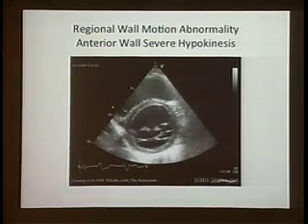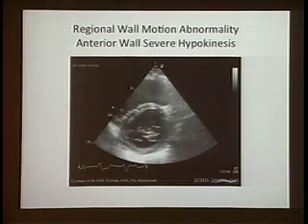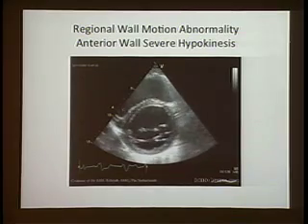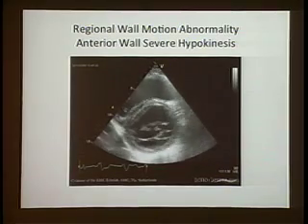And if you do an echo and you see something like this, you got a problem. And as I tell my residents, if you can pick up a problem, that's all I want from you. If you're going to pick up a phone and call me, you may not have the complete diagnosis, but if you recognize there's a problem, that's 90% of the issue.